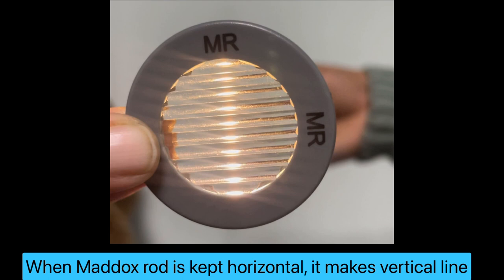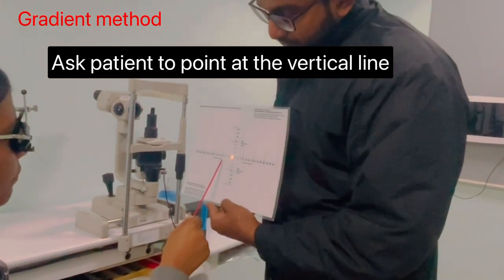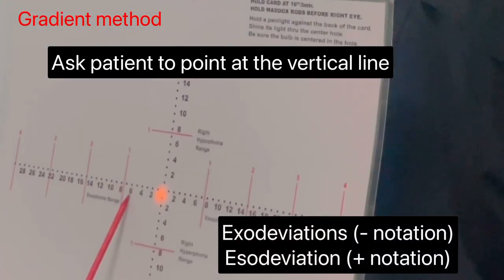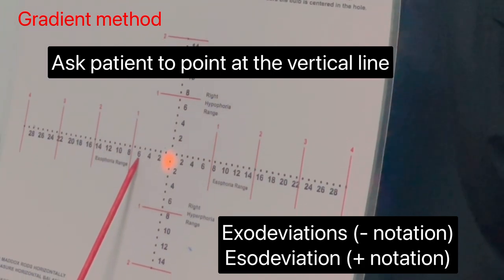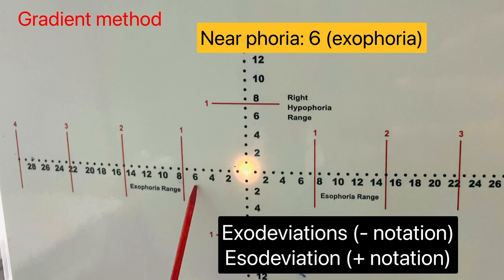When Maddox rod is kept horizontally, it is showing a vertical line. While performing the test, ask the patient to point the line seen by patient on a modified Thorrington chart. The line seen on the chart is the phoria present in the eye. Here patient pointed on six exophoria.